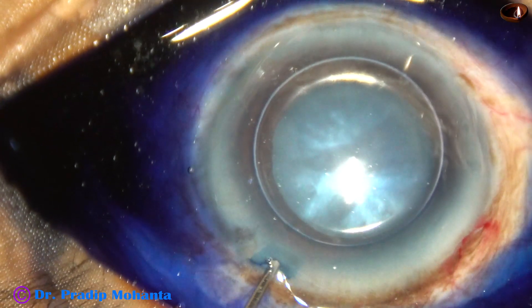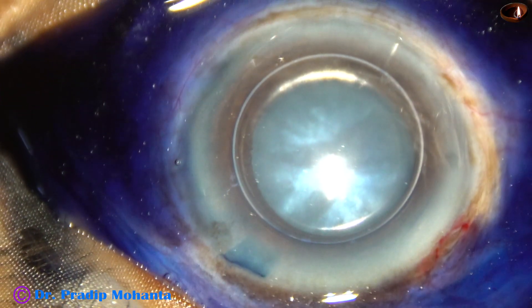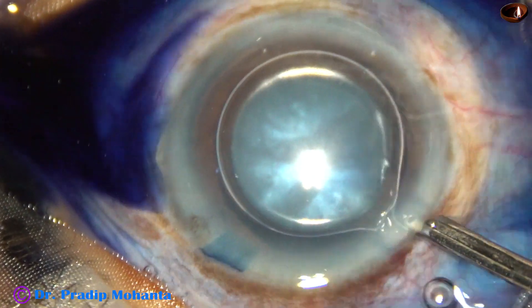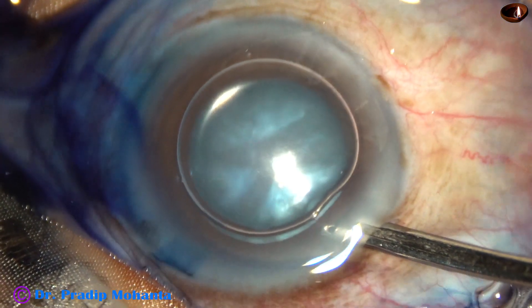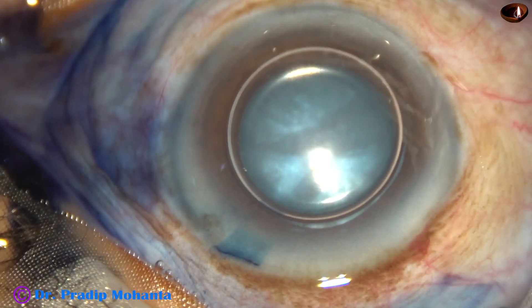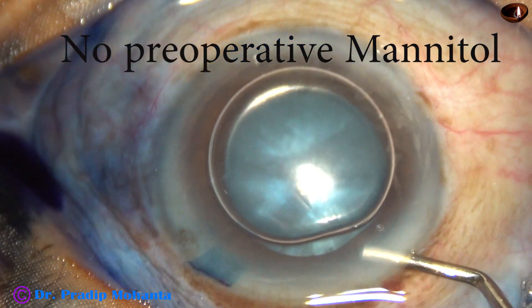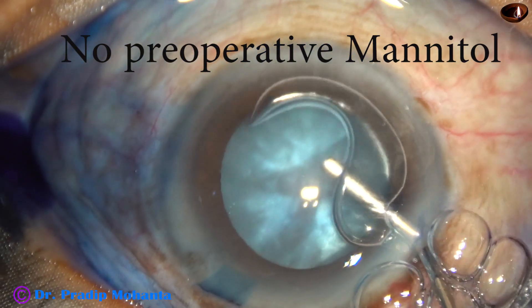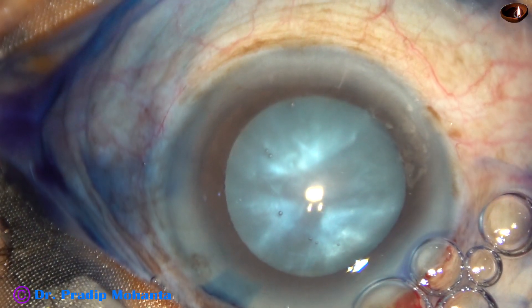The anterior chamber is very shallow and the anterior capsule is taut and very much convex. I have taken up this case for surgery. By this time, the main incision and one side port on the left side of the main incision have been made. The anterior capsule has been stained with trypan blue dye, and the anterior chamber has been filled up with viscoelastic.